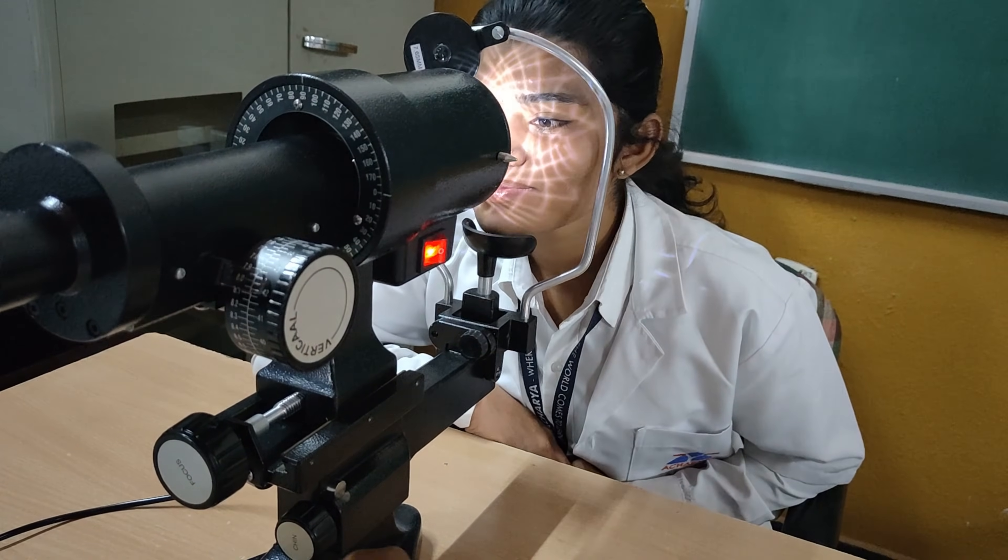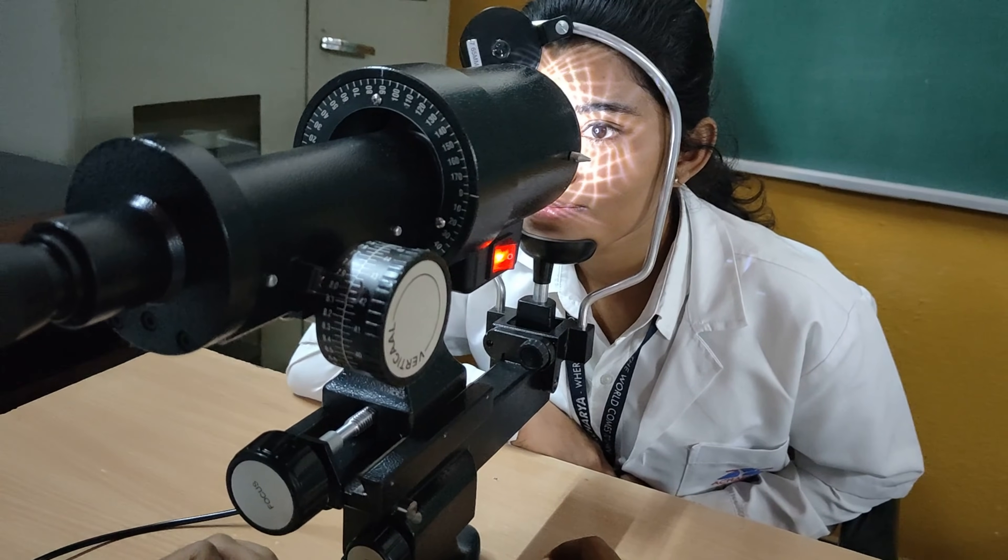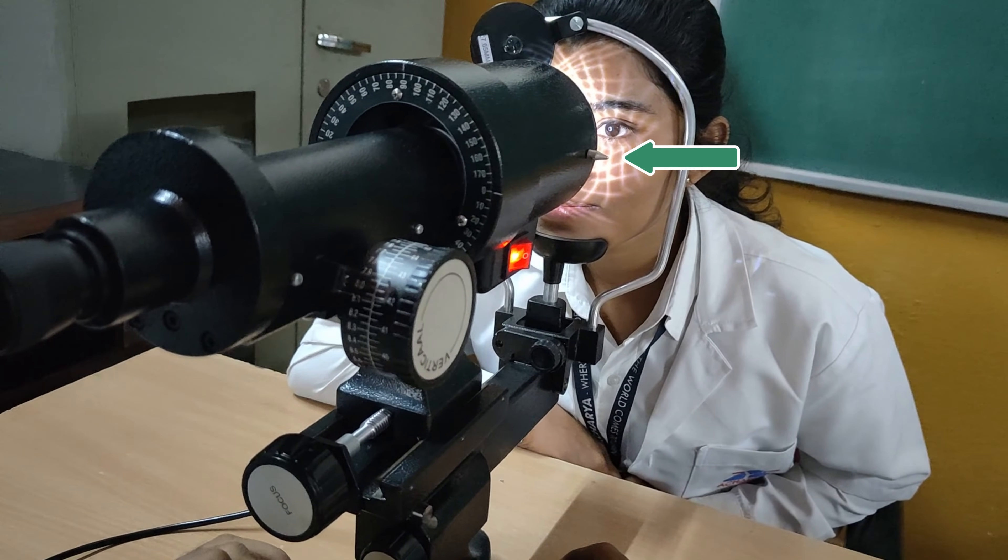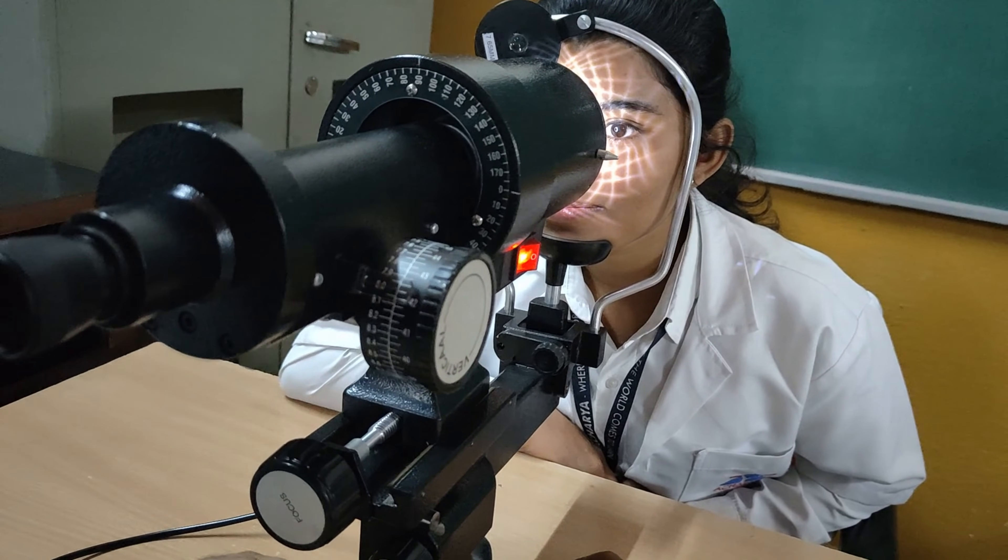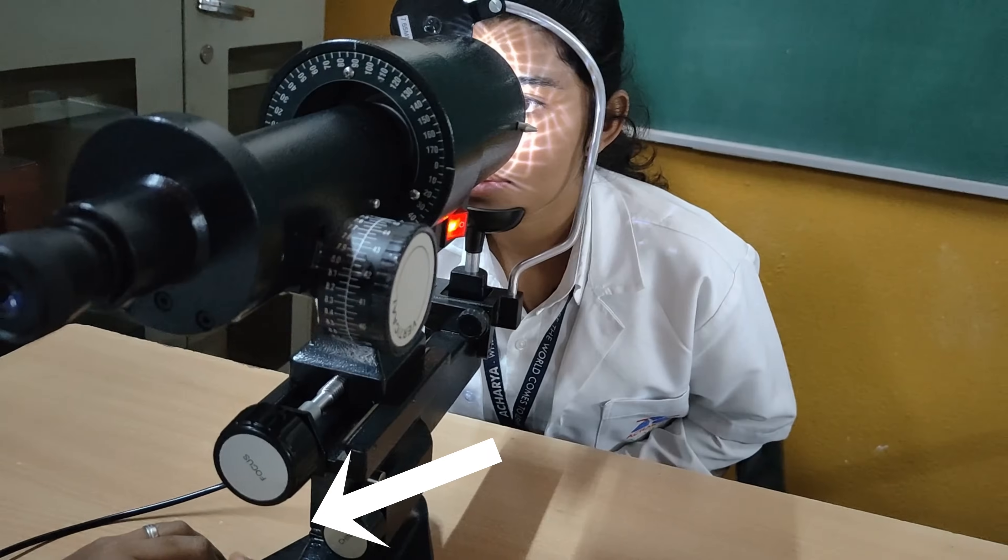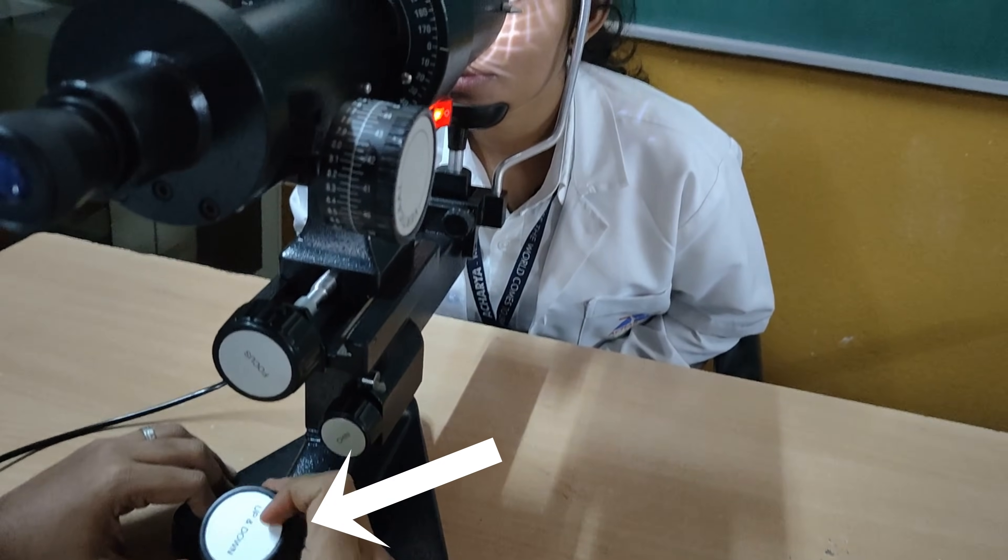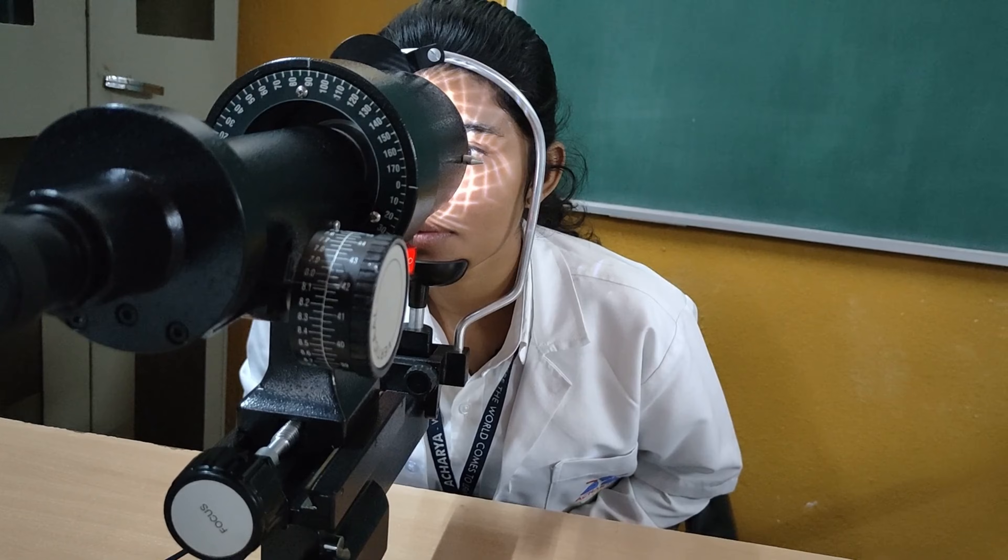Patient adjustment. Ask your patient to gently place their chin and touch the forehead. This knob should be aligned with the outer canthus of the subject's eye. You can adjust keratometer by raising or lowering the up and down knob and by moving it left to right.